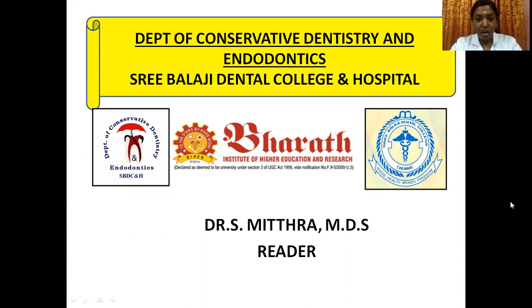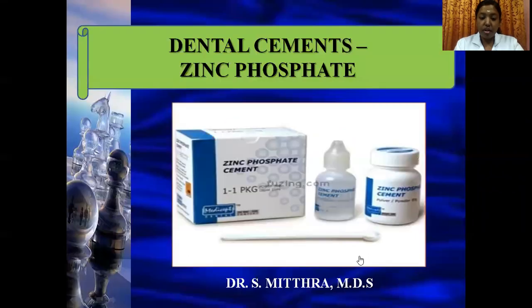And my presentation today is going to be about zinc phosphate dental cement. So let us go into detail about zinc phosphate cement. So I put the picture here where you can see zinc phosphate cement as such is available as powder and as a liquid.